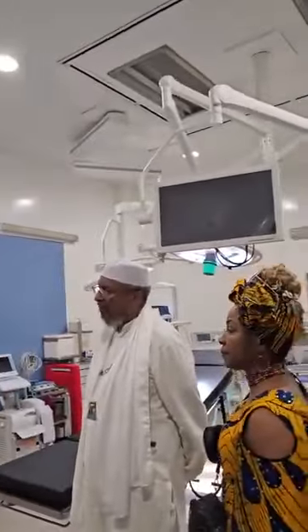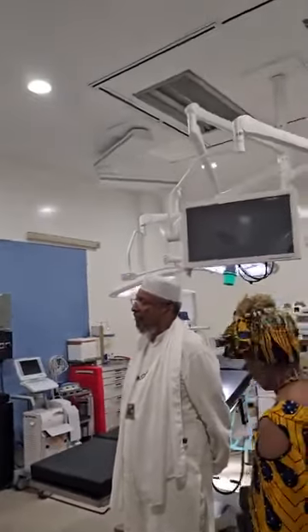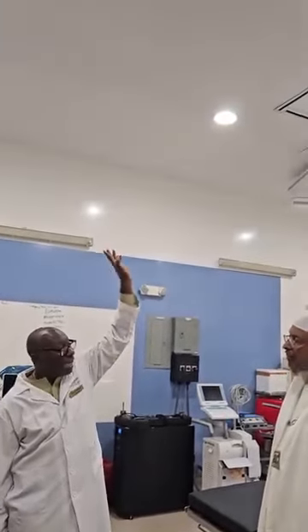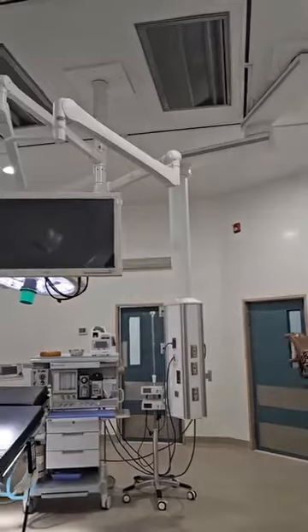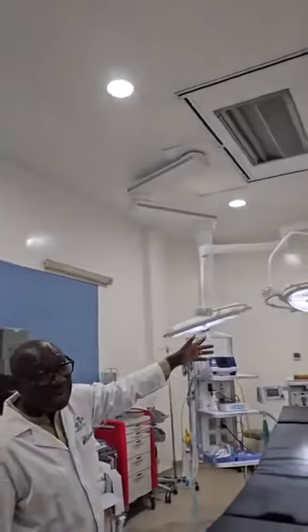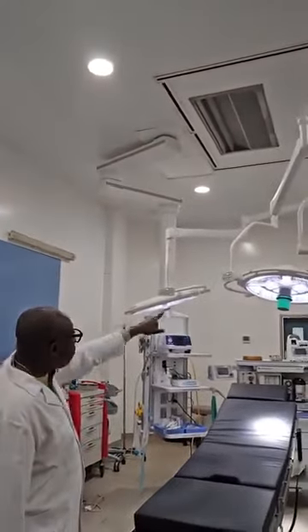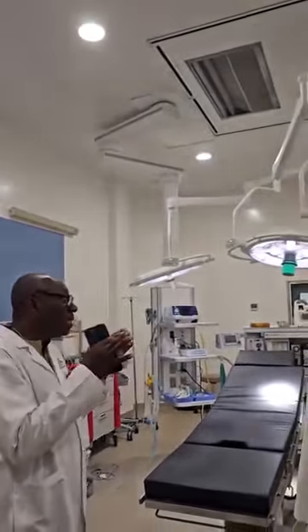We have a private company, Antennalos from Italy, to do this. That's why this is the only place in Jamaica that I'm aware of that has watertight or airtight construction, done specifically for operating theater. You see this thing is a laminar airflow hood. It's a complete corridor of air. You have two of these. What's recommended usually is 100 to 120,000 lux minimum, but we take 150,000 lux here and 150,000 here, 300,000 lux. So when our surgeons are operating, everything is crystal clear.